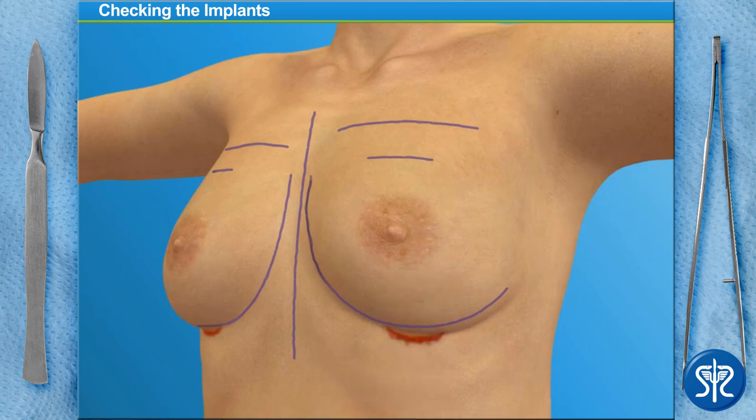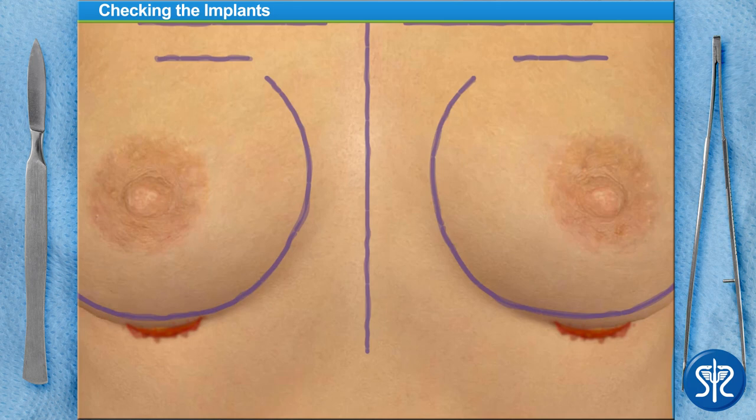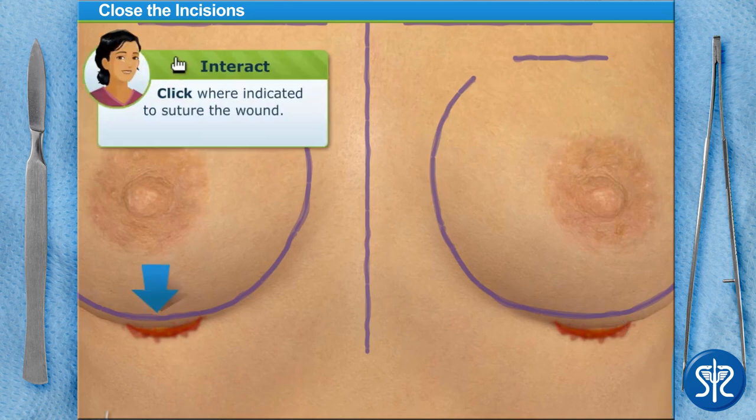Now we need to move our patient back to a flat position to prepare to close the incisions. With our patient lying down again, we'll inject some long-lasting numbing medicine into the incisions before closing. And now we're ready to suture the incisions closed.